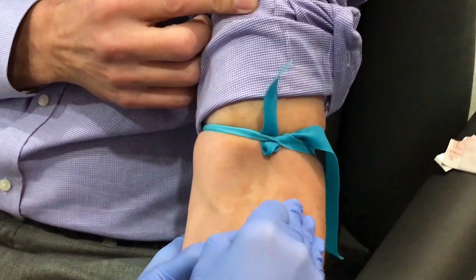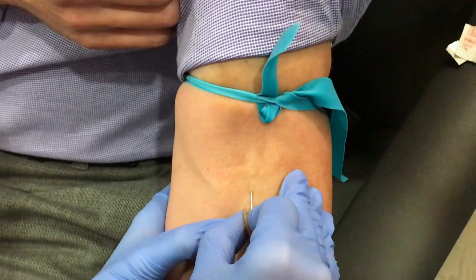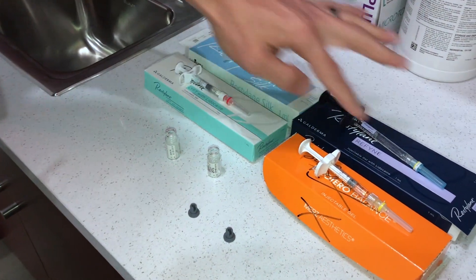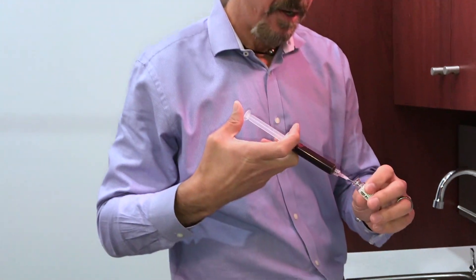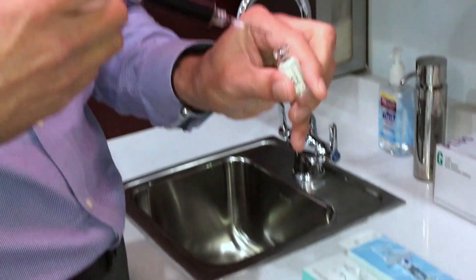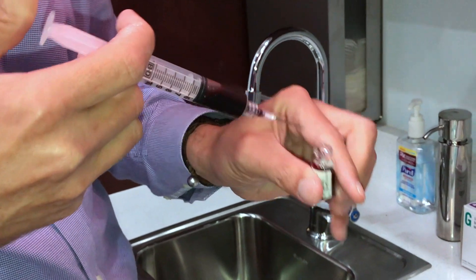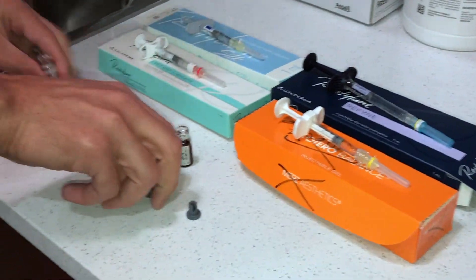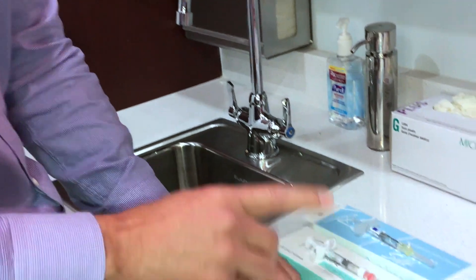This is for science. I'm getting my blood drawn because I want to debunk the aspiration myth. This is Mythbusters, and what I'm going to do is see if I can aspirate blood that is thinned with citrate using four fillers and the needles that come with each of them. I've drawn the blood and I'm going to put it into this Dysport vial, using two vials with citrate so it doesn't clot.